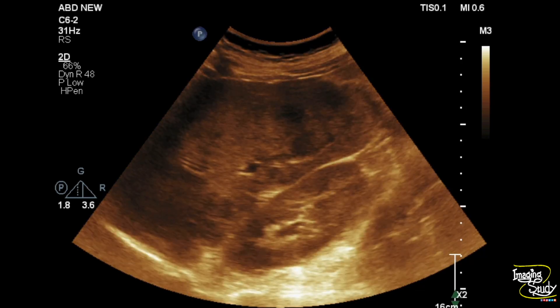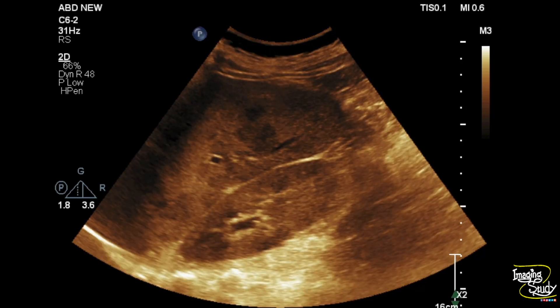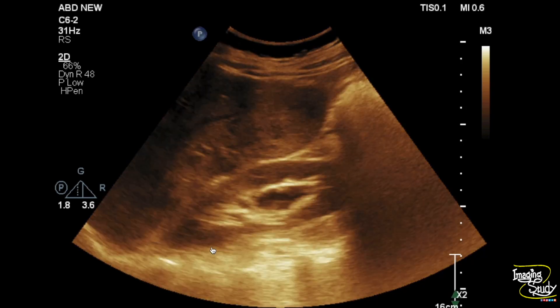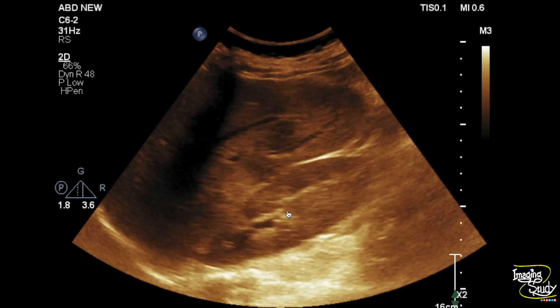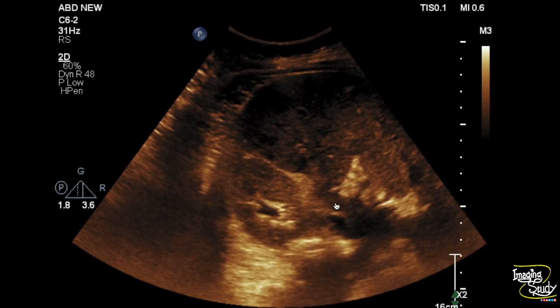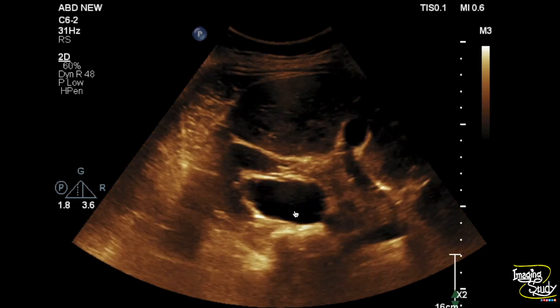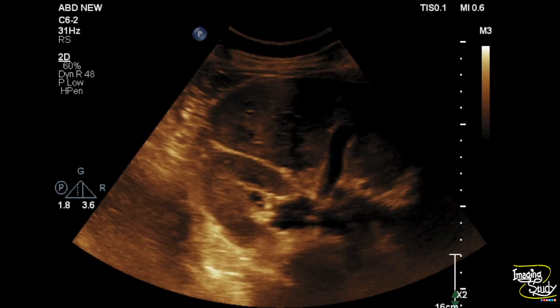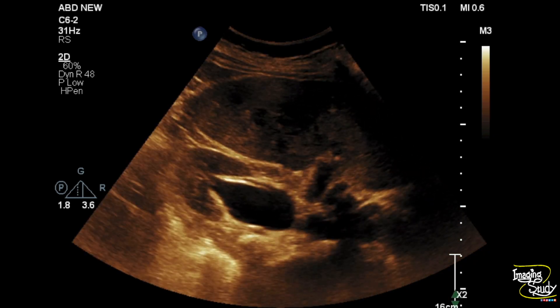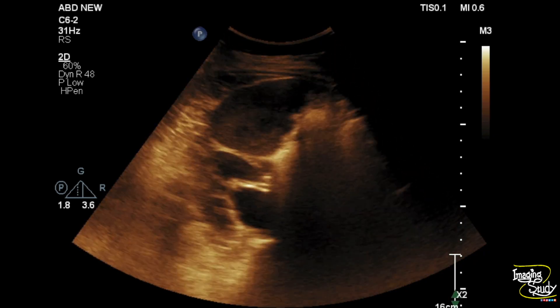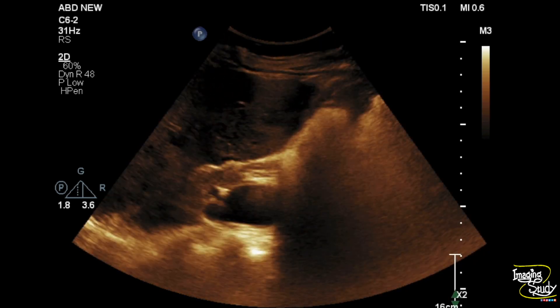Here you can see the right kidney showing mild dilatation of the pelvicalyceal system — that was an incidental feature. We couldn't find any definite cause for it on ultrasound.